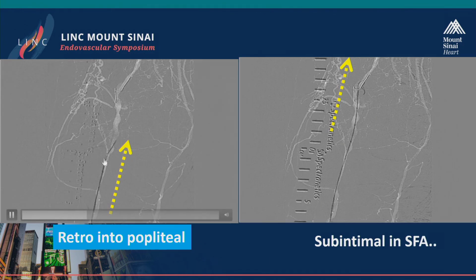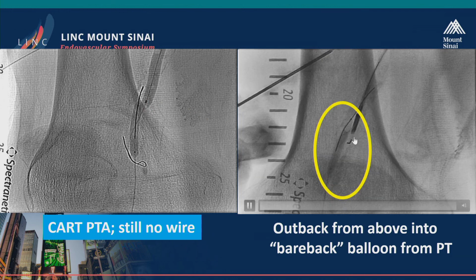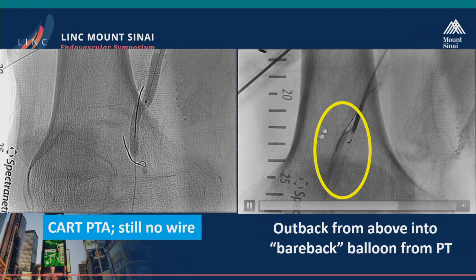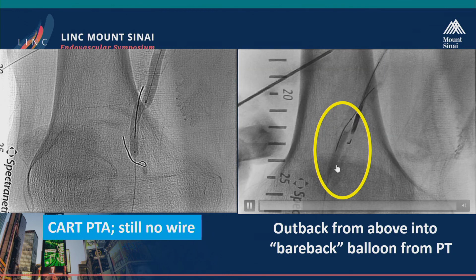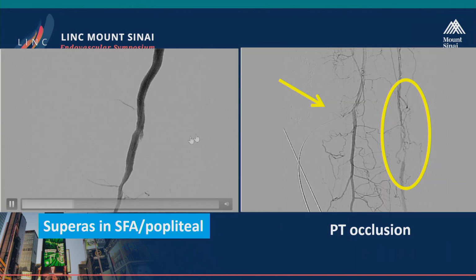And again, it's just a catheter and wire slow interaction till you go up. Every now and then it's hard in two dissection planes. So here's the CART that you've seen many times. That almost always works. Occasionally, as Dirk and others have taught us years ago, if you really have to, up here above the knee, you can puncture a balloon from below with an Outback from above.